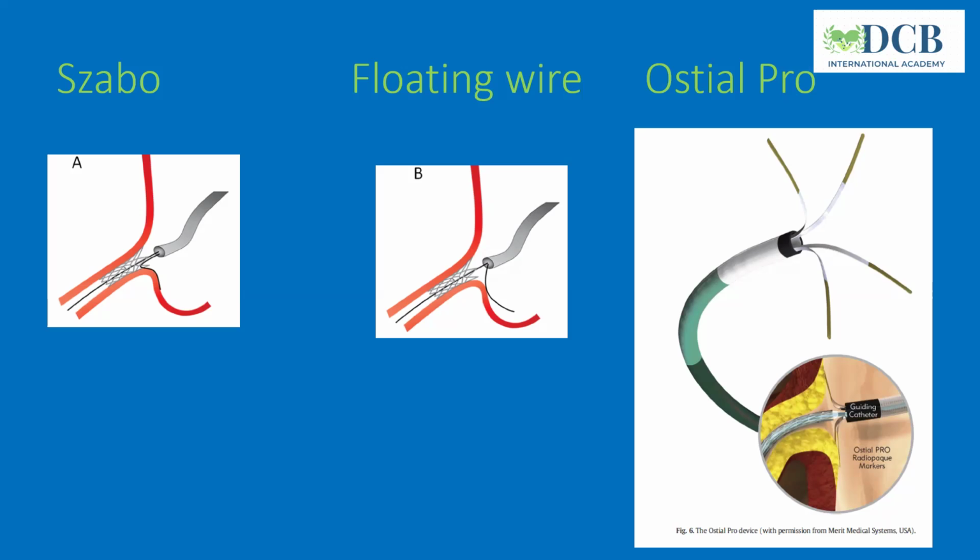Please bear in mind that not all stents are the same. In terms of distance between the balloon marker and the start of the stent, there can be big differences. For example, one interesting stent is the Create, and the latest version is Create Evo. That stent has a marker proximally that is angiographically visible, and you can use it as a marker. But that said, many stents have almost a millimeter between the end of the balloon and the start of the stent.